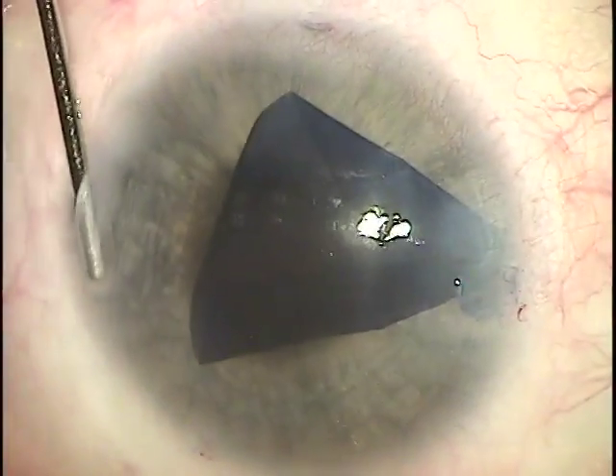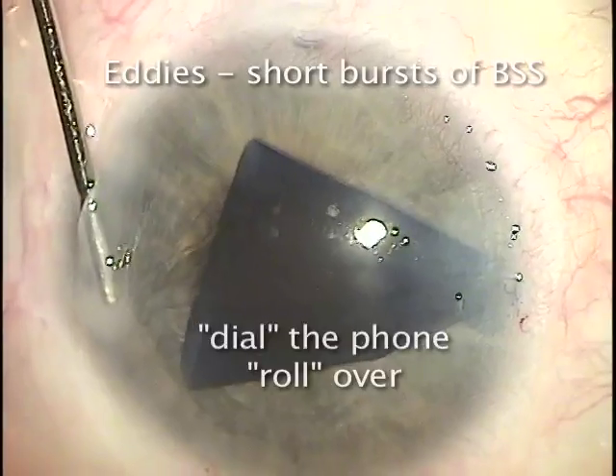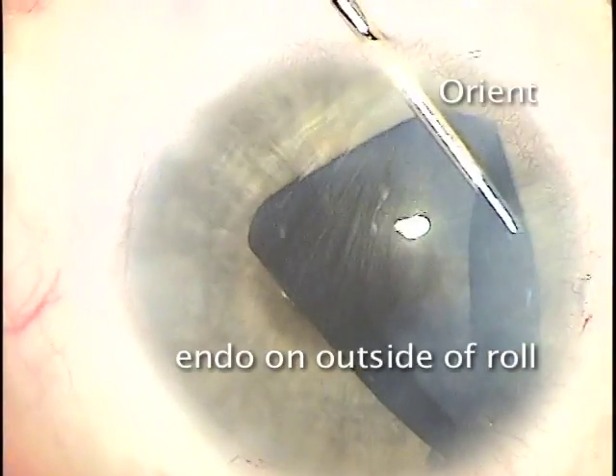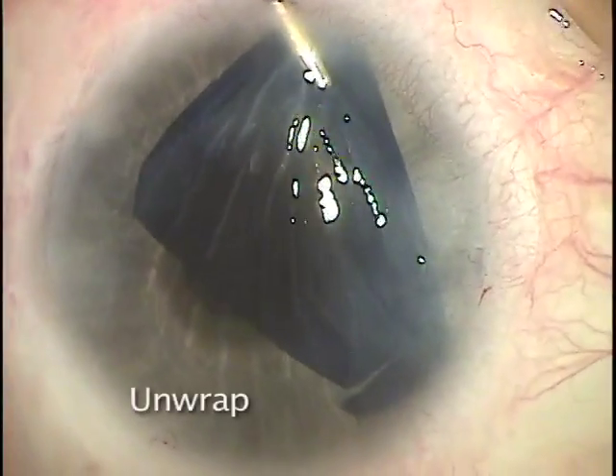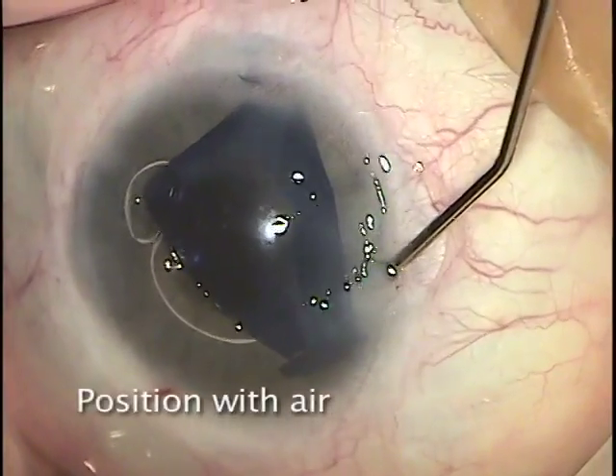Now you can see why it's called the Dead Sea Scrolls method. We'll use short, quick bursts of fluid to position the membrane, and when we're sure exactly that it's in the correct orientation with the endothelial side down, we'll unwrap it with a small bubble of air.